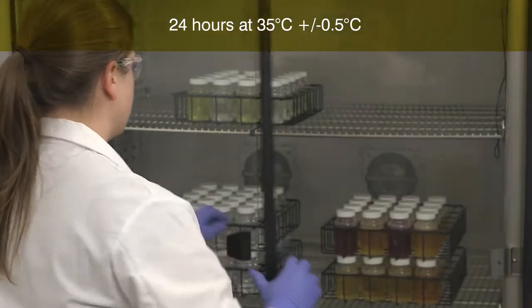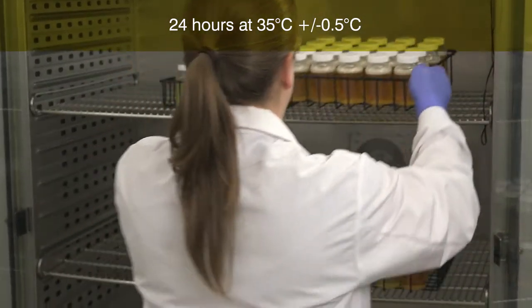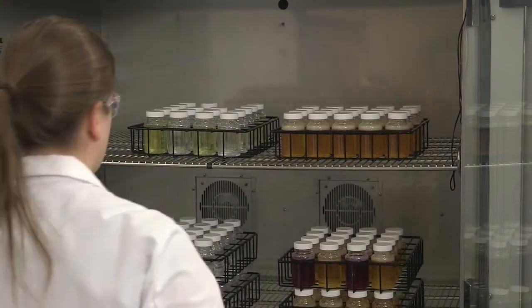Incubate for 24 hours at 35 degrees centigrade, plus or minus 0.5 degrees centigrade, or according to your local regulations.